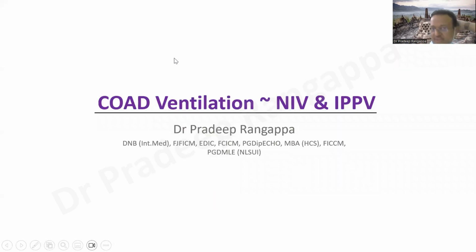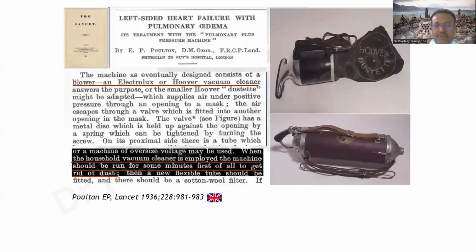The topic I was asked to talk on was COPD ventilation. How do we do ventilation in COPD in patients who are on NIV and in patients who are intubated and mechanically ventilated? So the first half of my talk, I'll be talking on NIV and its role in COPD. And after that, I'll be talking a bit on invasive ventilation. So over the next 20 to 30 minutes, I should be able to cover this.